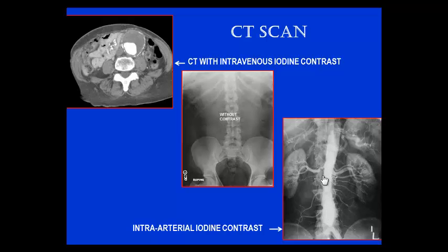But if we took a slice through the middle of the abdomen, right through that aorta, we might see the spine, and we might see something like this. So we might see this big aneurysm here, and we're seeing that contrast flowing in the center of the aneurysm right here, and this gray material out here is the clot outlining that aneurysm as well. So this would be a contrast enhanced CT scan with iodine, and that's what that slice might look like.